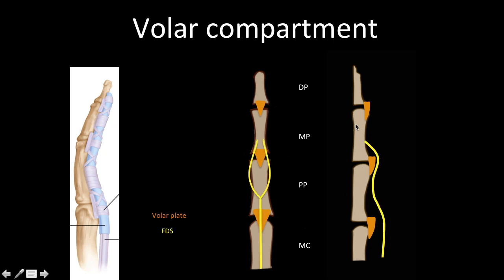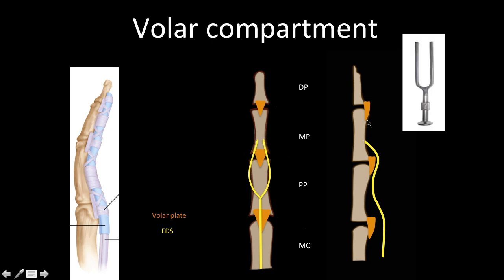Next is the flexor digitorum superficialis. This is a single tendon up to the base of the proximal phalanx, where it divides into two tendon slips that attach to the base of the middle phalanx — giving it the appearance of a tuning fork. The stem of the tuning fork is the single tendon, and after splitting it forms the prongs of the tuning fork.